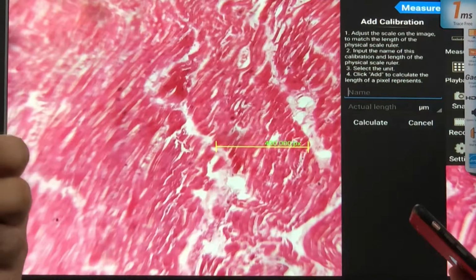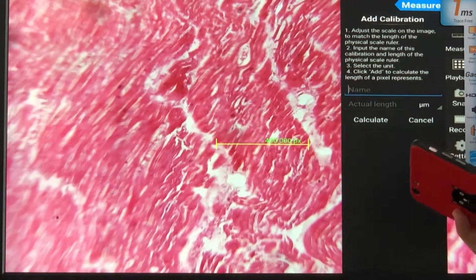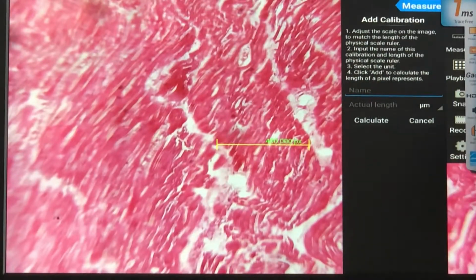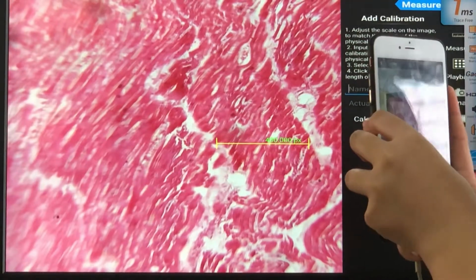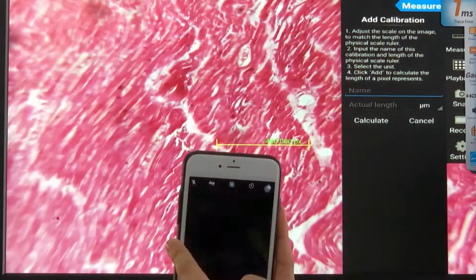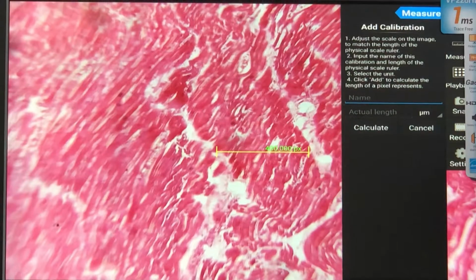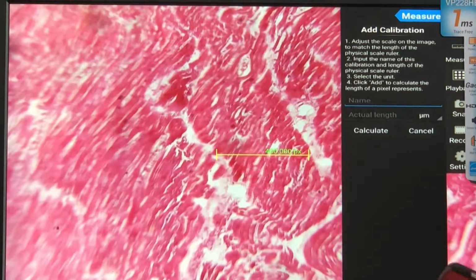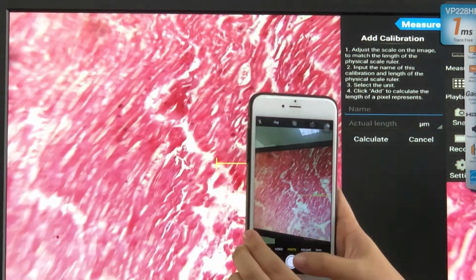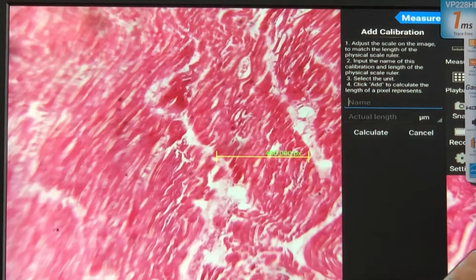Okay, so we go to slide number GCM1. Commonly, this is a common disease that we see in a clinical setting, but please do not biopsy the heart when you have a hypertensive patient, or else if you want to become a quack doctor, then you can do the biopsy. But please do not biopsy hypertensive heart disease. This is seen in autopsy specimens when the patient has died.